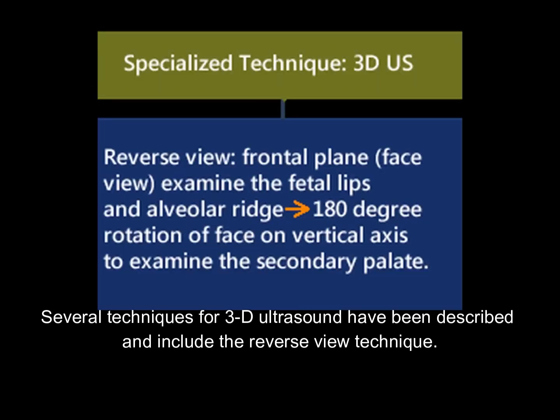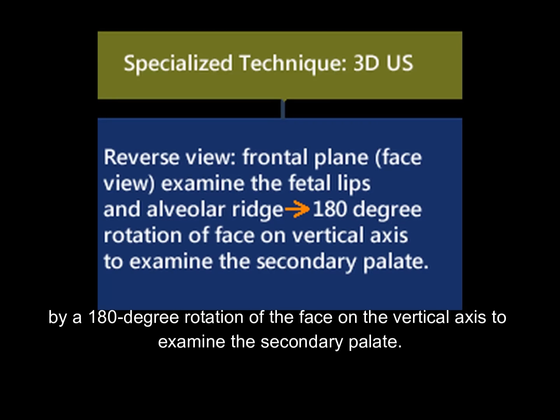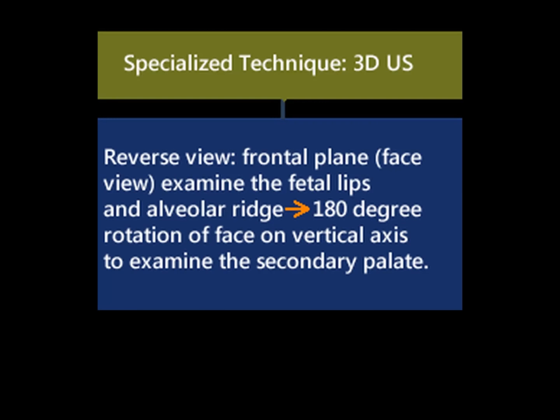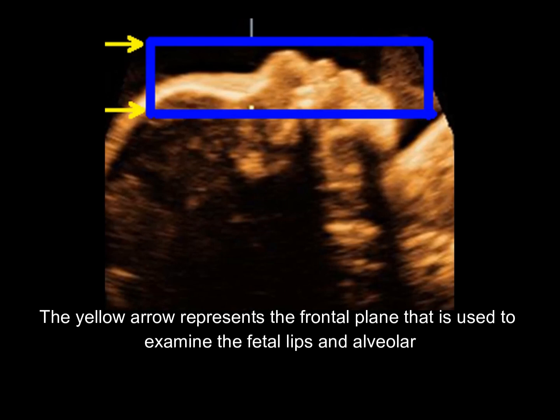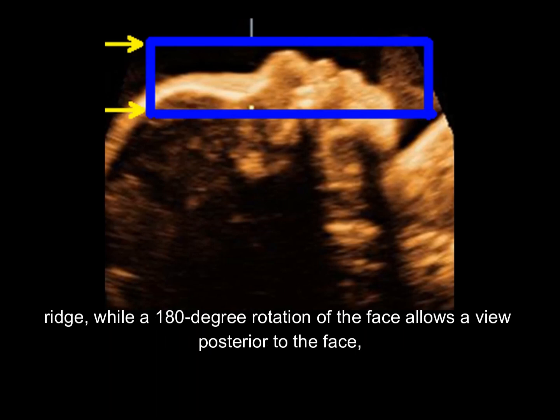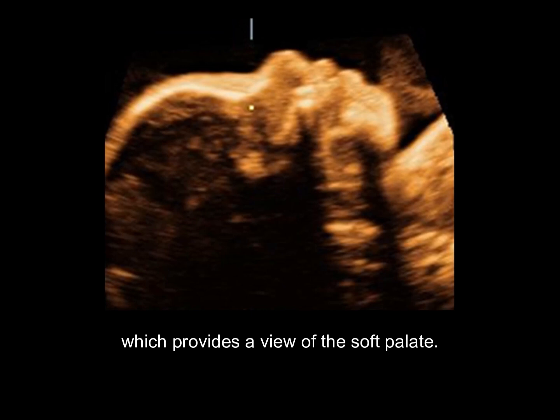Several techniques for 3D ultrasound have been described, including the reverse-view technique. In this technique, the frontal plane is used to examine the fetal lips and alveolar ridge, followed by a 180-degree rotation of the face on the vertical axis to examine the secondary palate. The yellow arrow represents the frontal plane used to examine the fetal lips and alveolar ridge, while a 180-degree rotation of the face allows a view posterior to the face, providing a view of the soft palate.